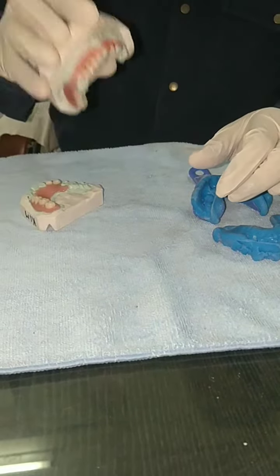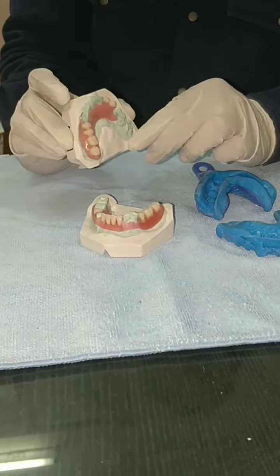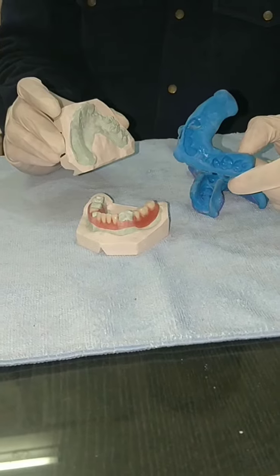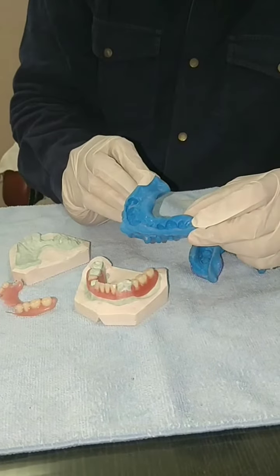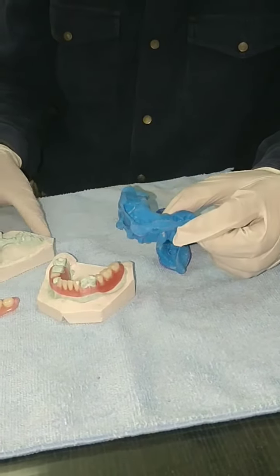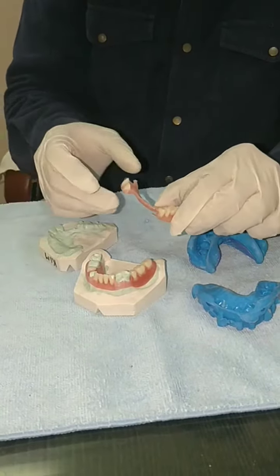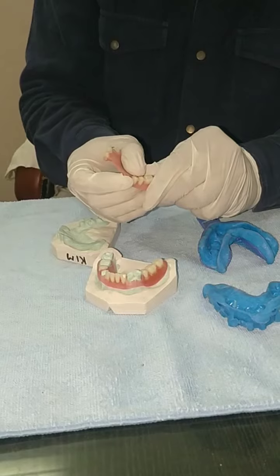So it will provide good retention — you can see the tension. Similarly, this is the upper acrylic partial. Patient Kim Miller sent me this impression, but it was out of the tray so we were not able to make it properly. They sent this impression and since it was out of the tray, you can see the cast was not proper. However, we have made this acrylic partial for them; it is a bit loose and they can tighten it by pressing the clasp inward.